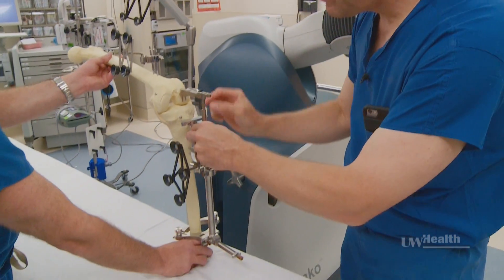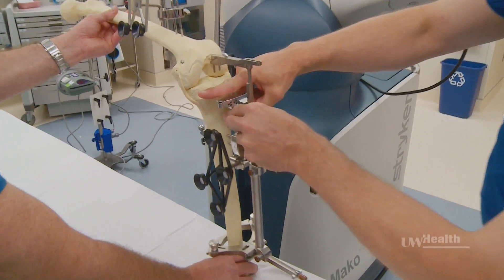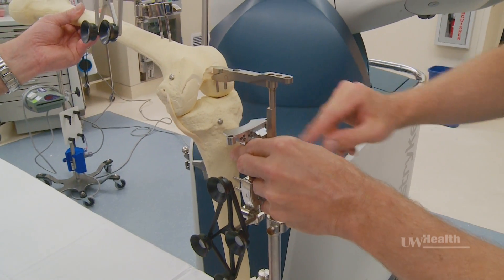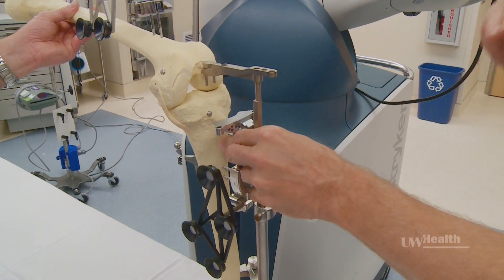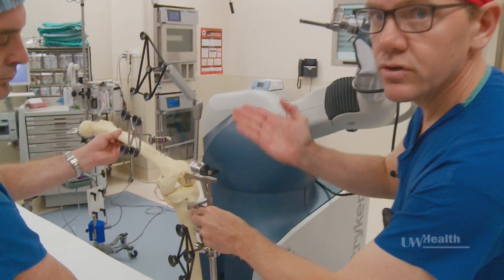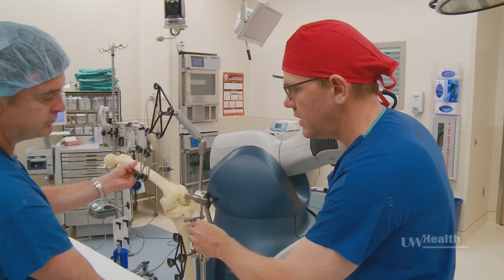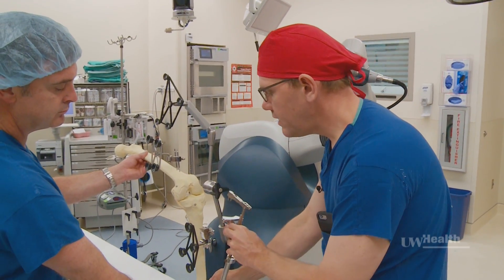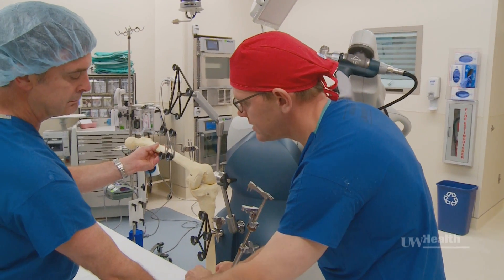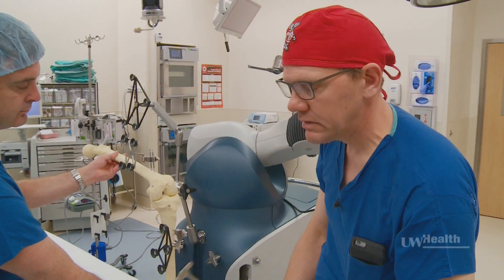We try and line this up and use this as a plumb line to make a cut that's perpendicular to the shin bone. That's the way the vast majority of knees in the United States are done right now.